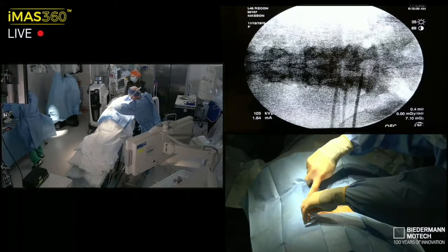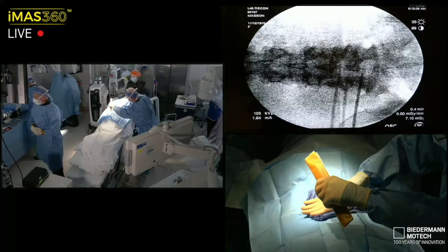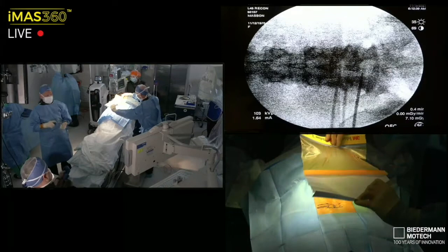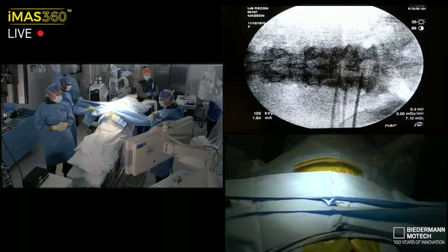Yeah, all right. So as we drape, let me just talk about a few things. I'm a big fan of small setup, very precise, efficient, and meticulous use of tools. I don't like a lot of extra clutter, particularly in an outpatient environment. The advantage is if you can get to your 99th percentile of tools and equipment and all the instruments, it really helps the entire environment. So we really have a Mayo stand, and then one single back table.